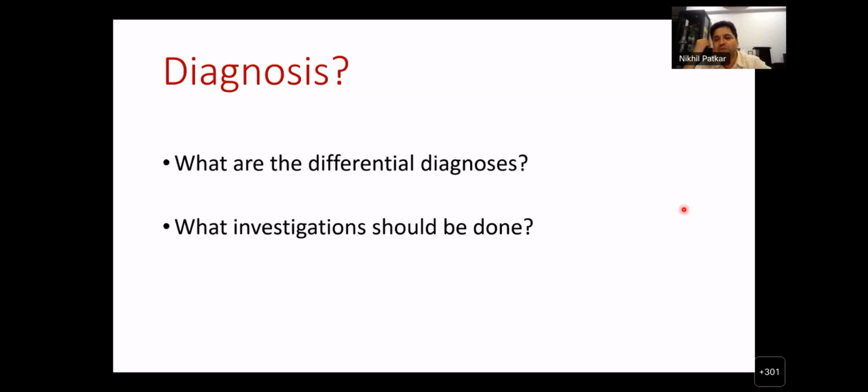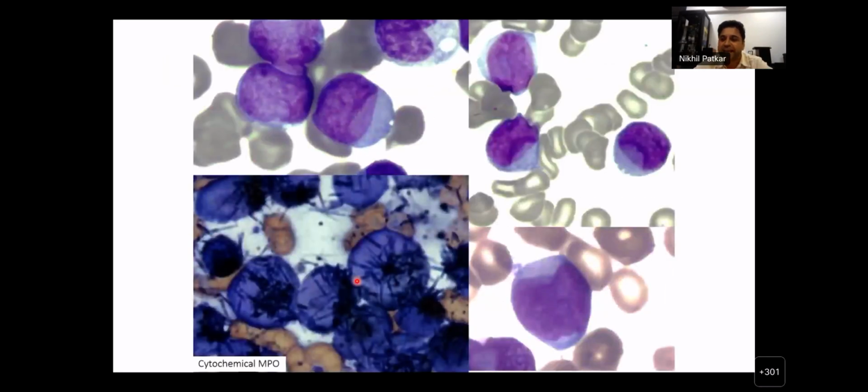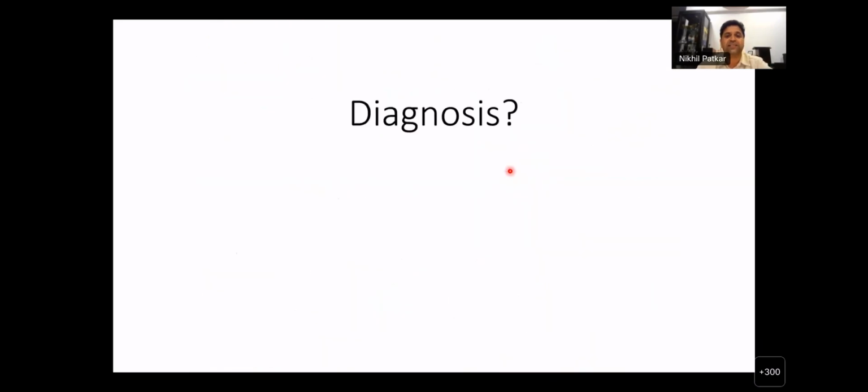The question here is why monocytic leukemia? So, by definition, monocytic leukemia will never have intense MPO positivity. Okay, the MPO positivity in this particular case is intense. If you told me that I think this could be APL, I would say, okay, looking at the MPO, the intense MPO staining is there. Now, the key thing that you noted here is that these blasts have these cup-like projections, okay? And this is a distinct category altogether of, as you rightly said, it is possibly an NPM1 mutated AML, but that does not mean this is monocytic at all. These are not monocytic lineage cells at all, right?